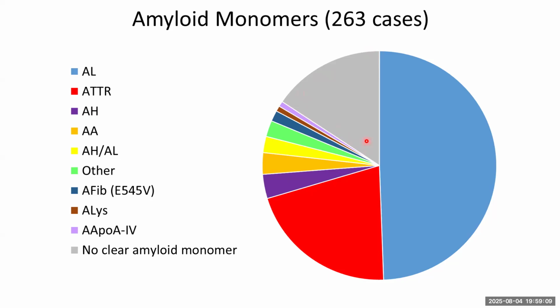If we can identify 300 or 400 proteins in a biopsy, but not see anything particularly suspicious, then maybe the amount of amyloid in that tissue is below 0.01% of the total mass of protein, and we're going to struggle when the dynamic range is so wide. So we feel we've done pretty well to get about 85% of the time something quite clear cut that we feel confident about bringing forward in our report.